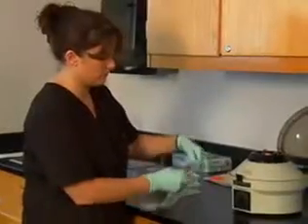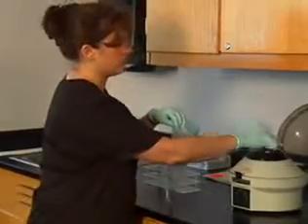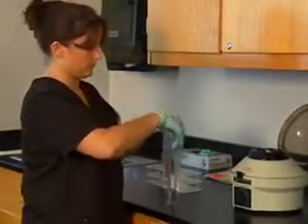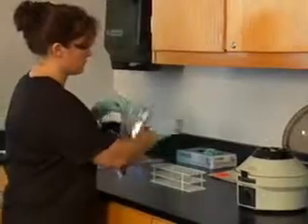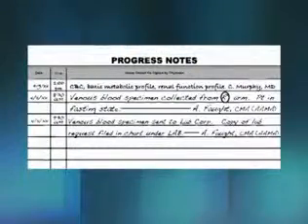Prepare the specimens for transport to an outside laboratory for testing according to the medical office policy. Place the serum separator tubes and the lavender tube in a biohazard specimen bag. Remove your gloves and insert the laboratory request in the outside pocket of the specimen bag. File a copy of the lab request in the patient's chart. Sanitize your hands and chart the date the specimen was transported to the laboratory in the patient's record.